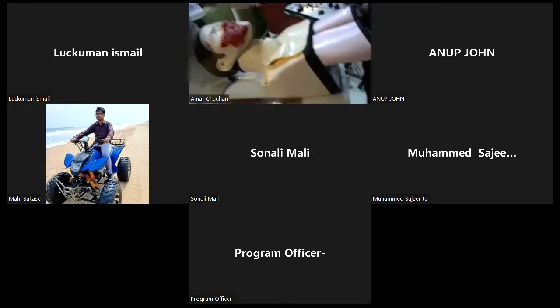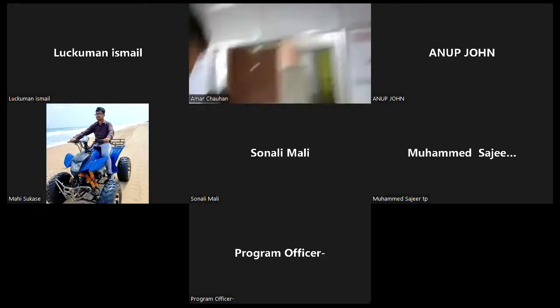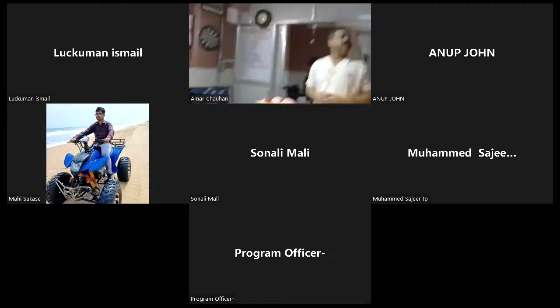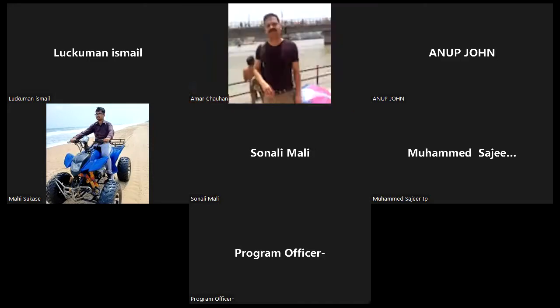Right. Okay. Thank you, Doc. Okay. Thank you very much. Okay, that's all. Hopefully others, yeah. Okay. Yeah, Lukman, others will be done, sure.